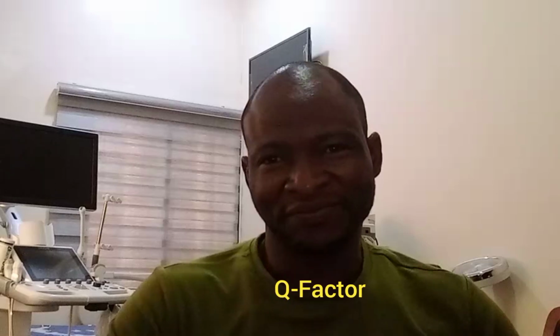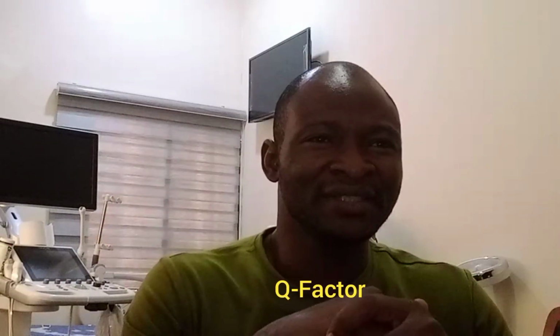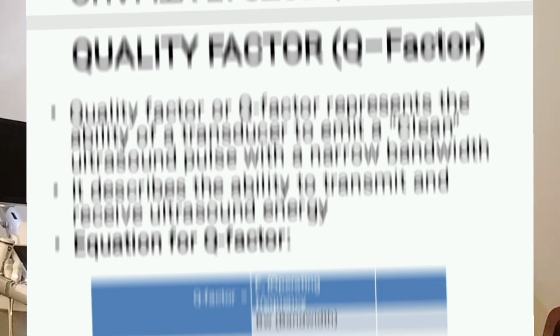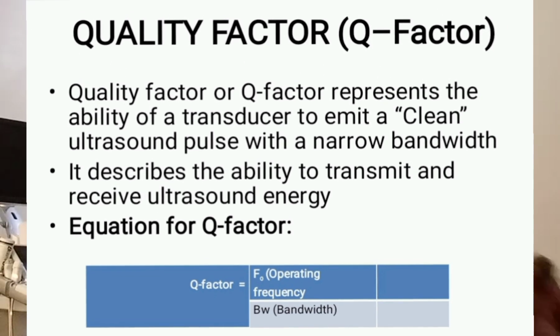Q factor, otherwise called quality factor. This represents the ability of a transducer to emit a clean ultrasound pulse with a narrow bandwidth. It describes the ability to transmit and receive ultrasound energy. This is the equation for the Q factor, which is operating frequency over bandwidth.